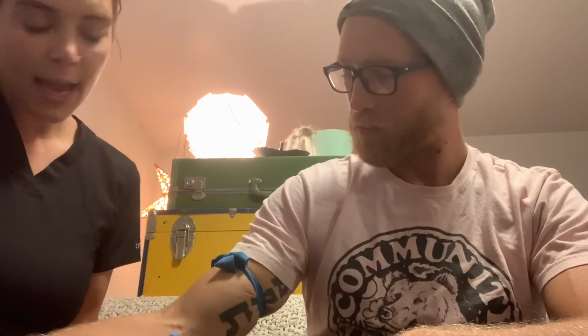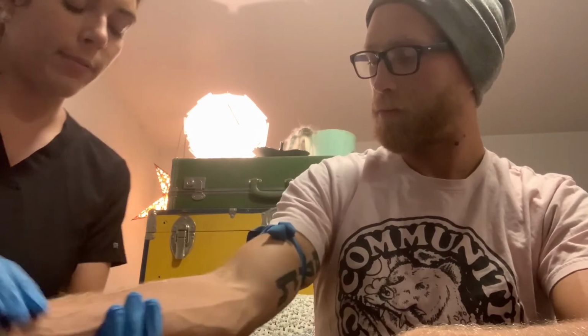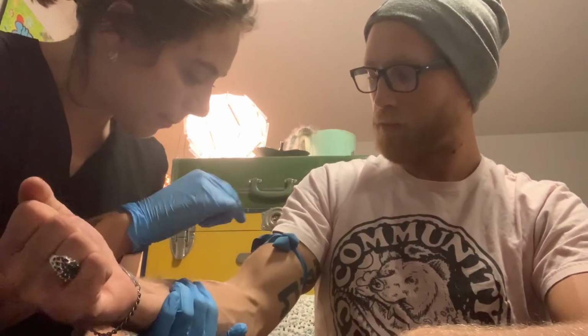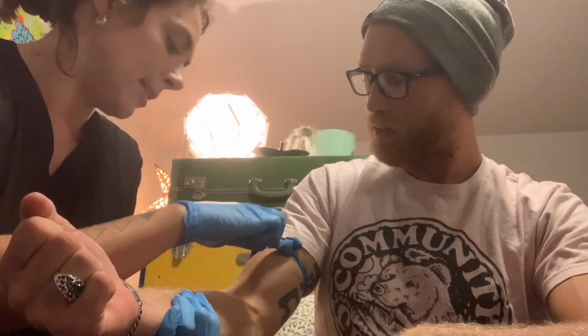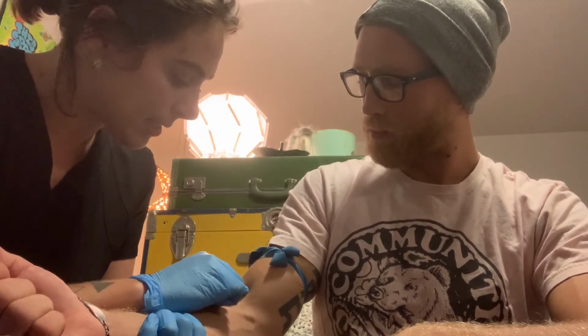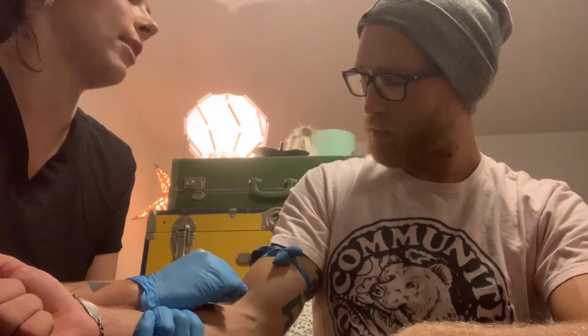Okay. And you can promote vein distension to select your veins by having the patient place their hand in a dependent position and maybe even asking them to flex their fingers. And I'm going to be stroking down from distal to proximal, just below where I think would be my proposed site here. And I'm going to press down with my index finger here and note that soft, bouncy feeling of his vein here.